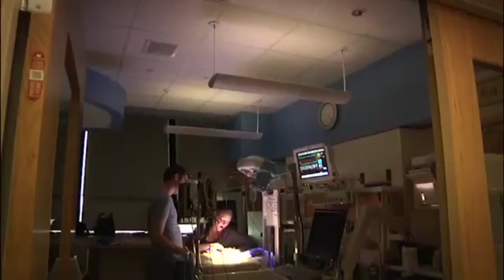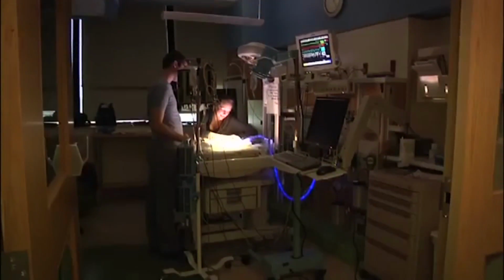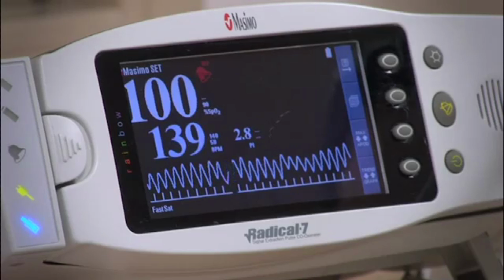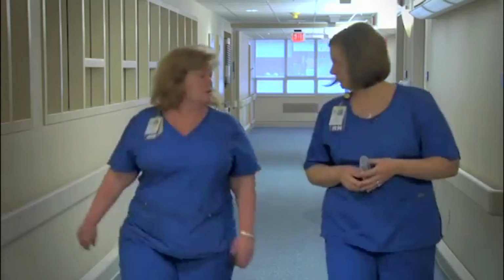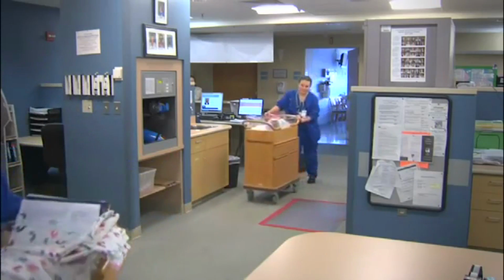Since around 1995, there have been research studies to look at the best way to improve detection for these babies, and pulse oximetry was used as a screening tool. This oxygen saturation measurement can help us to determine if a baby may have critical congenital heart disease. At Children's National, we have been working over the past several years to promote the use of pulse oximetry in screening. We came to Holy Cross Hospital because they have been an early adopter of screening protocols for babies.